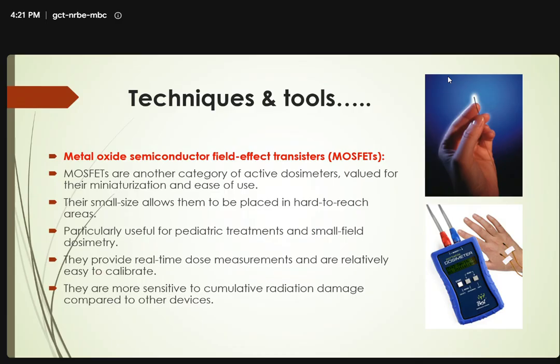They provide real-time dose measurement and are relatively easy to calibrate, but they are more sensitive to cumulative radiation damage compared to other devices. It means their life is up to a certain dose received by them, and if the dose level defined by the specification is reached, after that it will be damaged and will not be useful for any measurement.